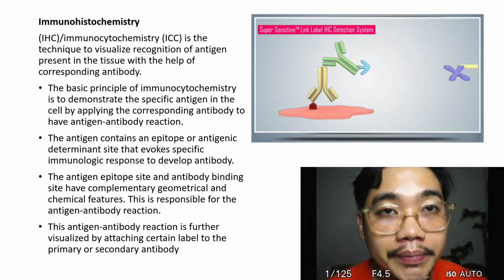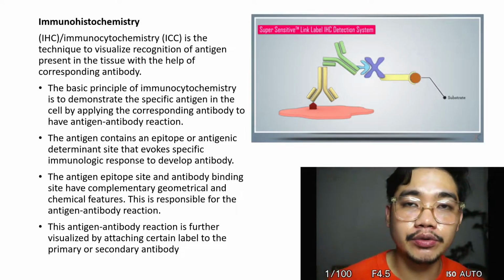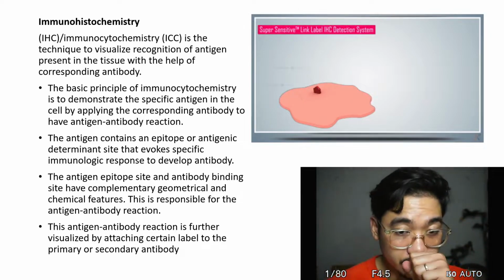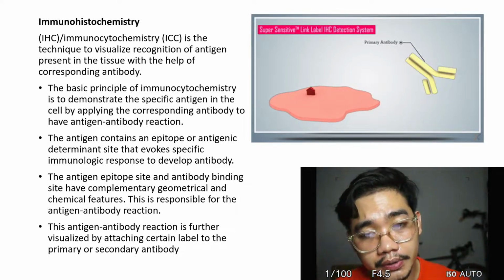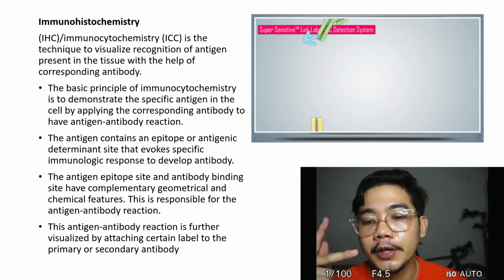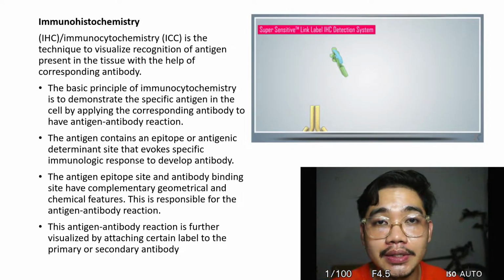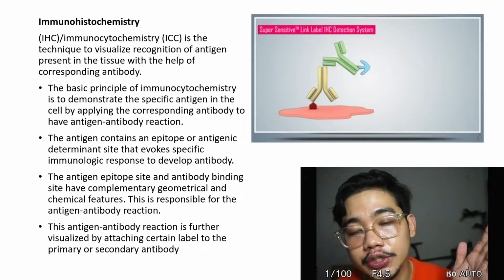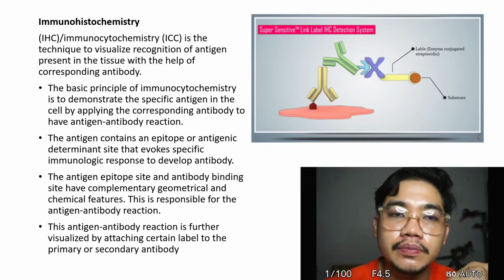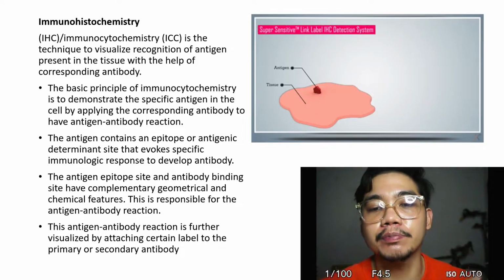It's produced by big laboratories and they use lots of techniques which we will talk about later, like your hybridoma. So anyway, what happens is when the primary antibody attaches to our target antigen in the specific tissue that we want to identify, the FC portion usually is exposed.